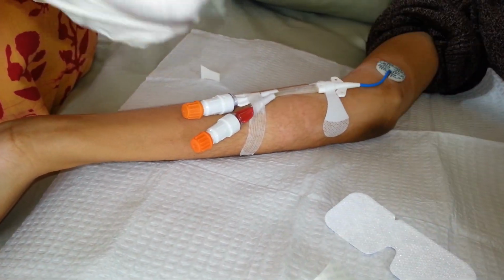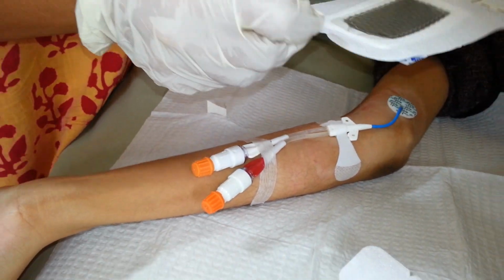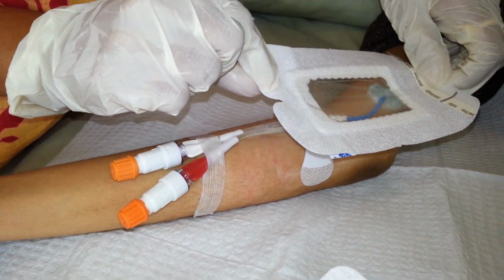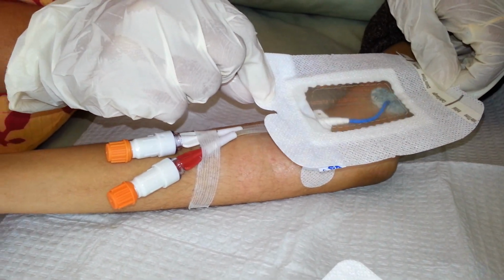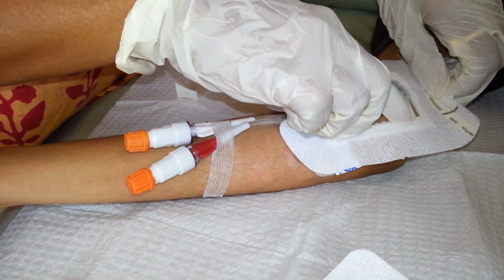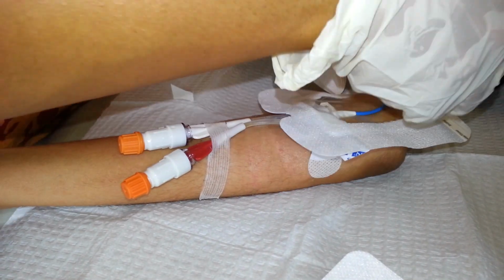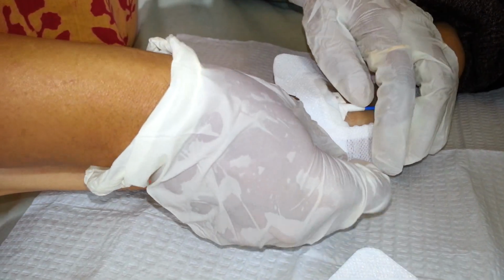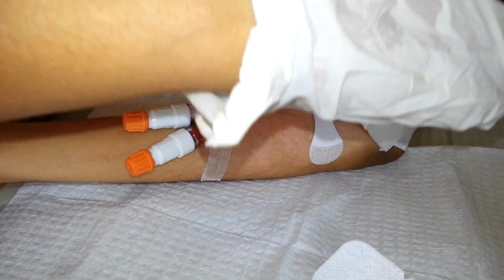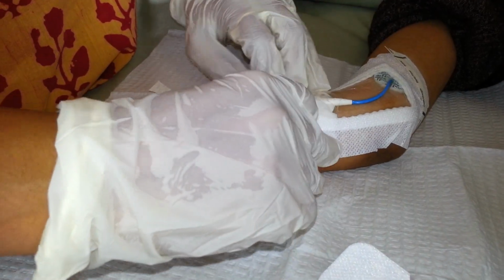Hold the dressing from the edges carefully so it does not stick to the fingers. Align the bottom slit of the dressing with the lumens. Position it such that the Biopatch and insertion points are also visible. Stick it and tap it lightly along the edges to secure it in place.